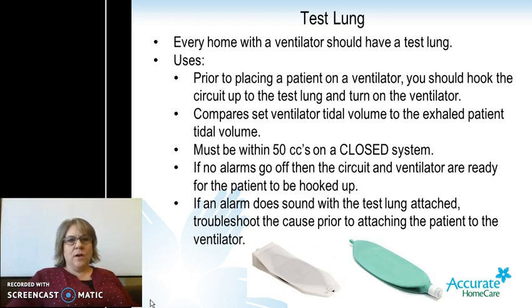Likewise, if you are there in the morning and you need to get them out of bed, you need to assure that the wheelchair ventilator is also working. You need to put the test lung on the wheelchair battery, turn it on, and while that is running, you can get the patient prepared. Then you can easily transfer them over to the wheelchair ventilator if no alarms have been going off.